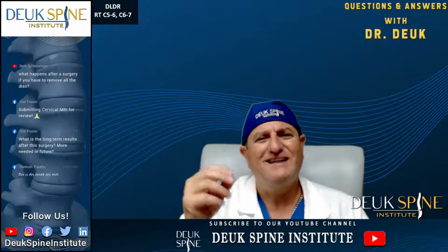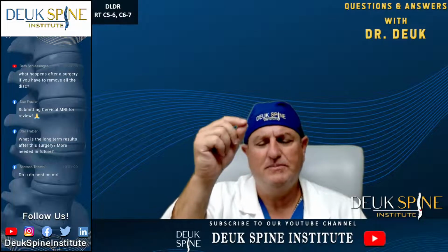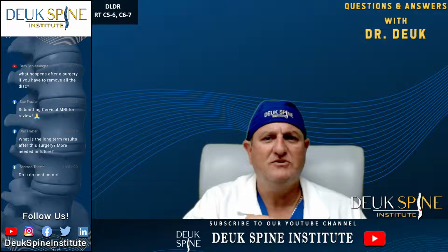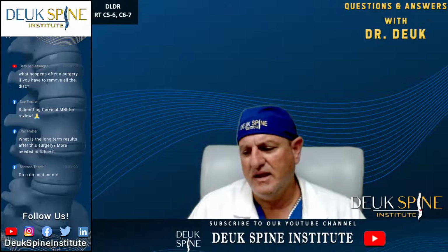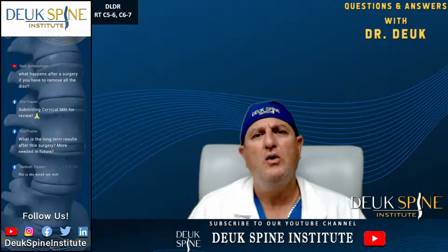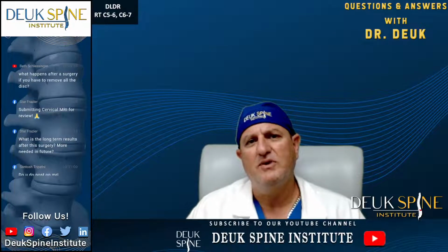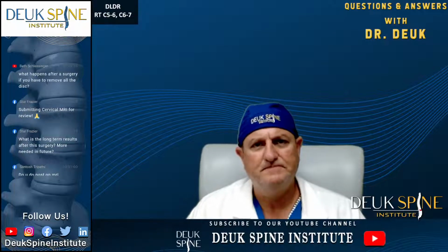And so it's not the desiccation that causes symptoms. It is an inflammation in the posterior tear. We showed you that video during the surgery. Go back and rewind it and you'll see it. We discovered that here at Deuk Spine. That is why we're the only ones that can cure people's neck pain with surgery, because we know exactly where the pain's coming from. And it can be reached with the laser endoscopically.